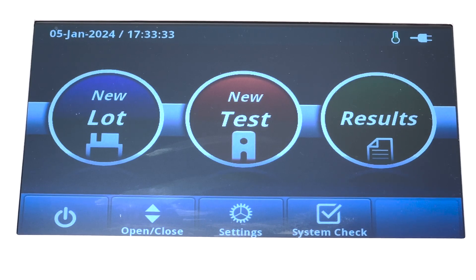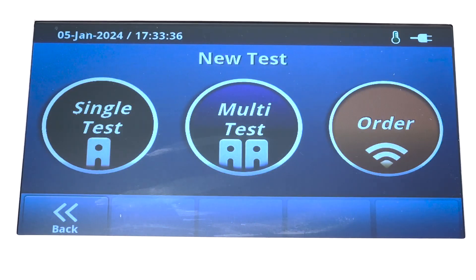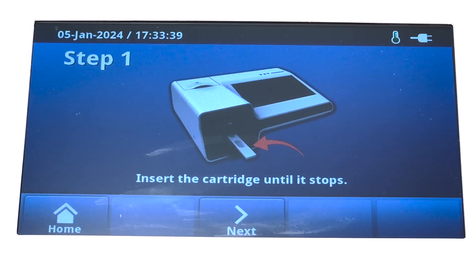Please follow the on-screen instructions on the VET Chroma. The VET Chroma offers how-to instructions and shows you step-by-step how to perform your testing procedures.